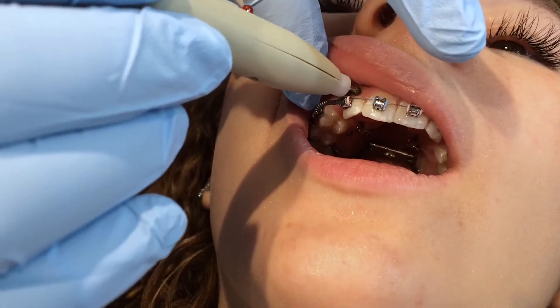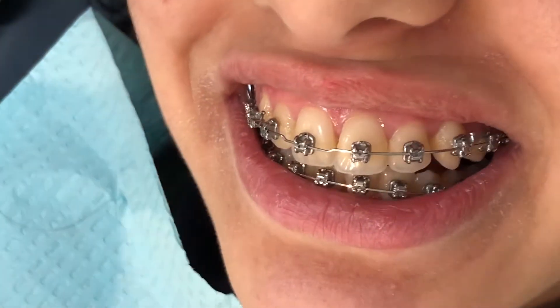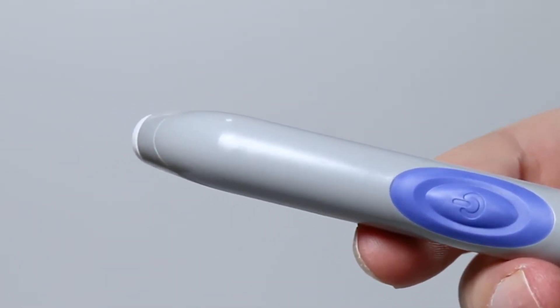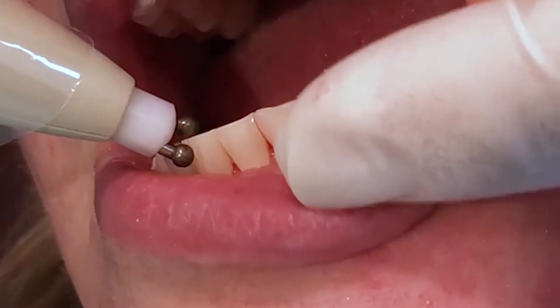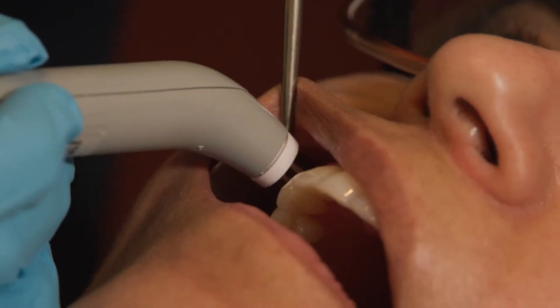Tooth sensitivity, orthodontic, surgical, and canker sore pain vanish like magic thanks to the Dental Pain Eraser's groundbreaking use of Pulse Wave technology. Thirty seconds of application will relieve the pain of any tooth in the mouth or any region for up to 48 hours and sometimes beyond.